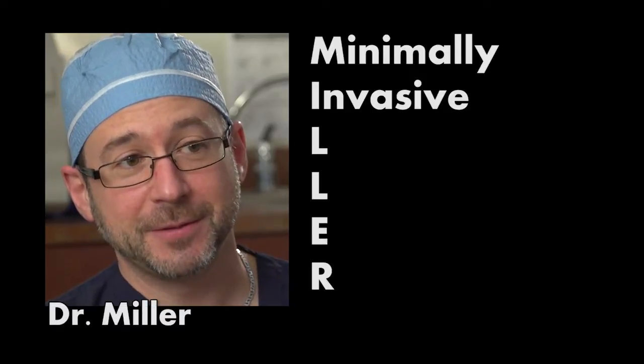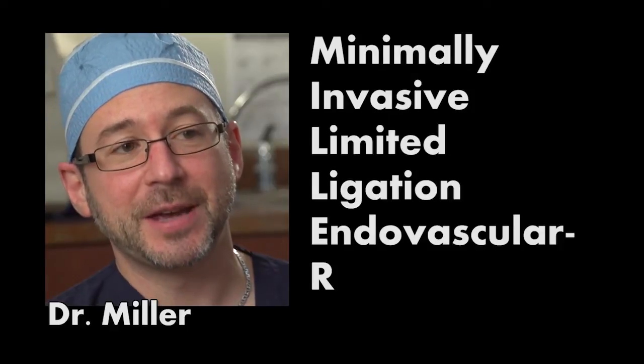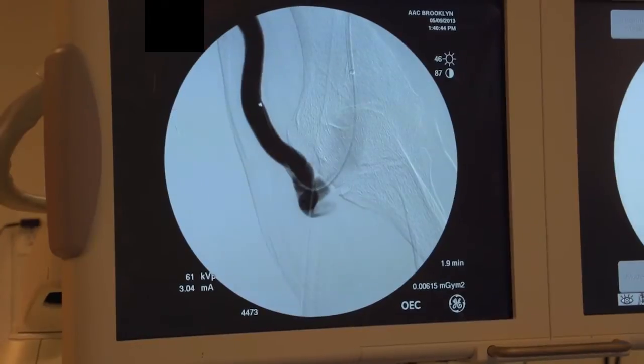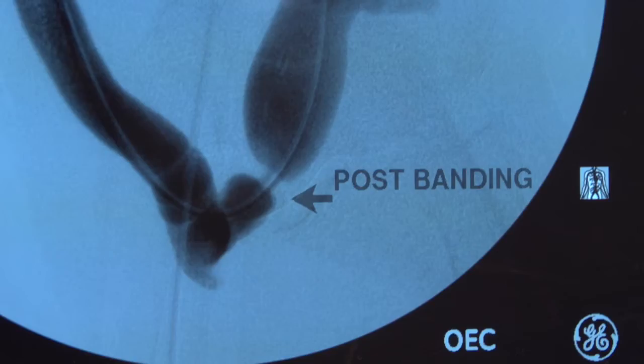The MILLER procedure is an acronym standing for Minimally Invasive Limited Ligation Endovascular Assisted Revision. Every interventionalist who does procedures will come across this problem where a patient presents with a hyperpulsatile access. You treat the outflow stenosis, and by the time the patient is getting off the table, they are already complaining that their hand is numb and cold.